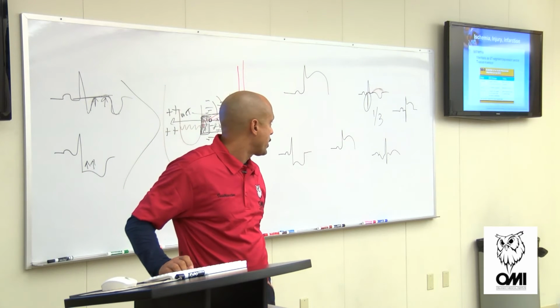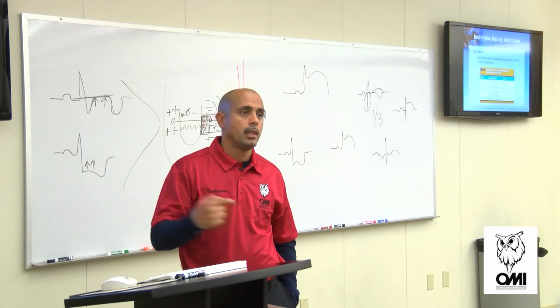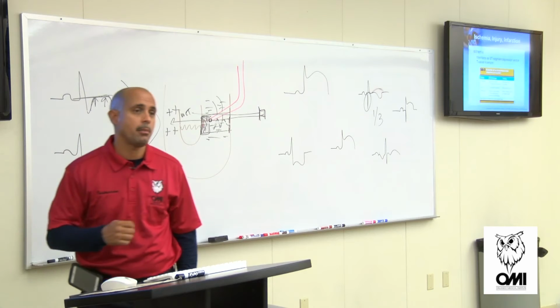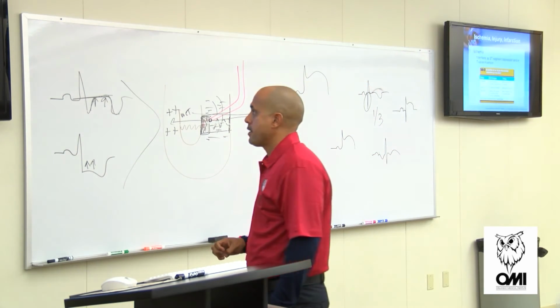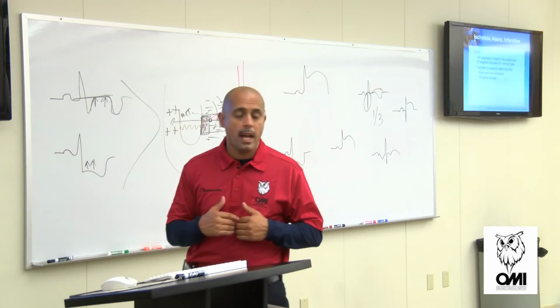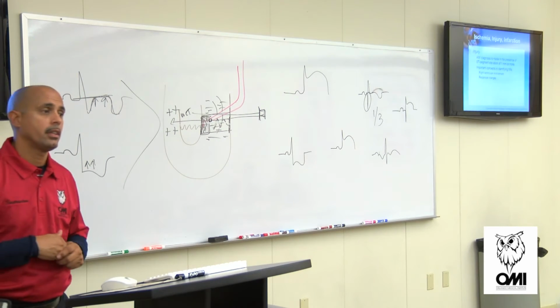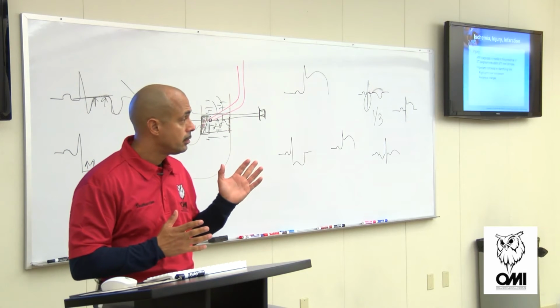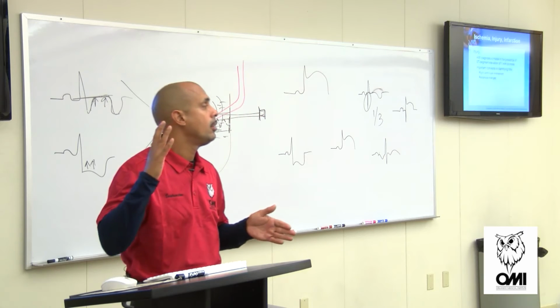All right, so ischemia, as I mentioned, starts from the endocardium and works its way through, and is represented with ST depression and/or an inverted T wave, okay? As it moves on to injury, it is now going to have ST elevation. Once again, ST elevation can only be seen if transmural. Very good. Which means, from the endo all the way to the epi.